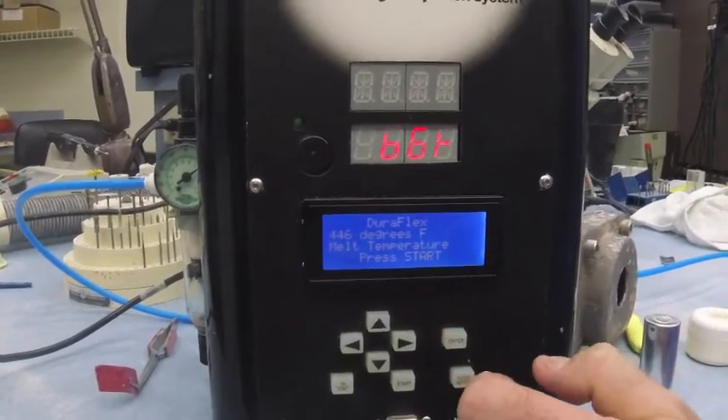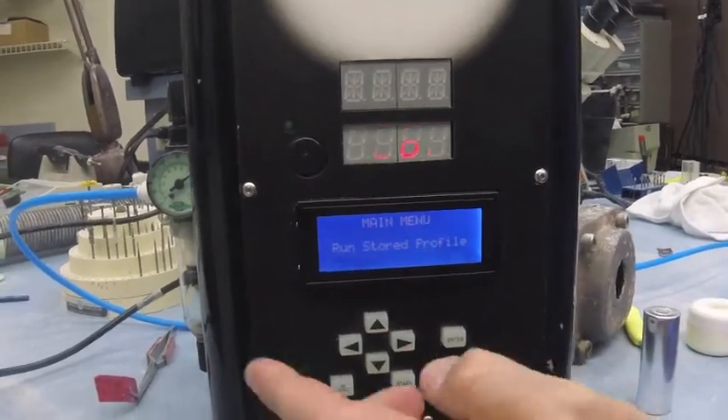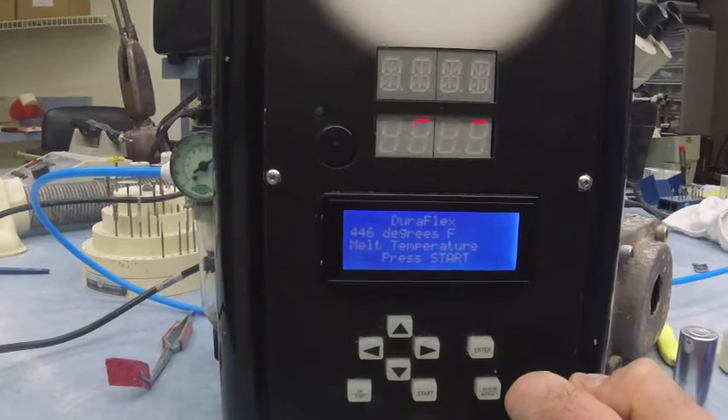Hit enter. If you choose anything and think, 'Oh shoot, I meant Duracetal,' you can always hit the back button and it'll take you right back to the start again. So: store profiles, Duraflex, hit enter.